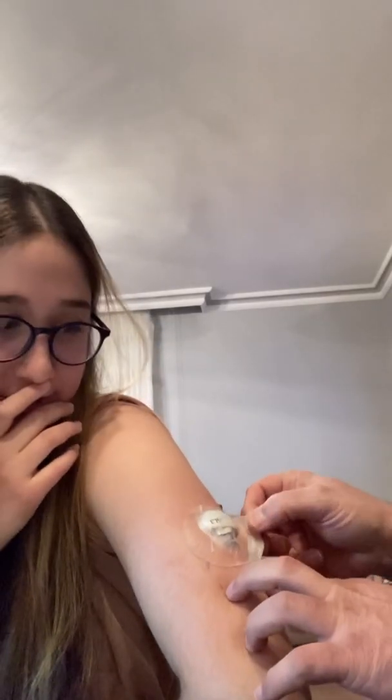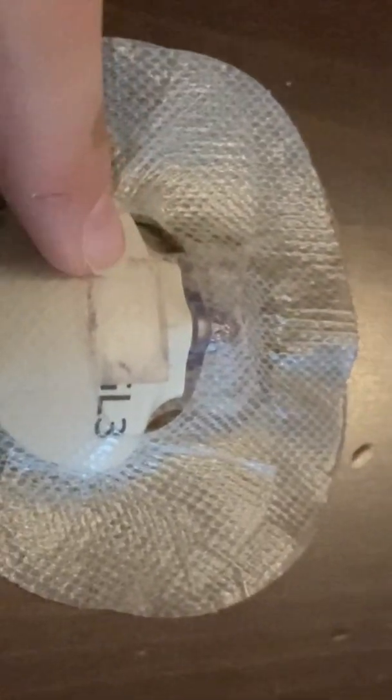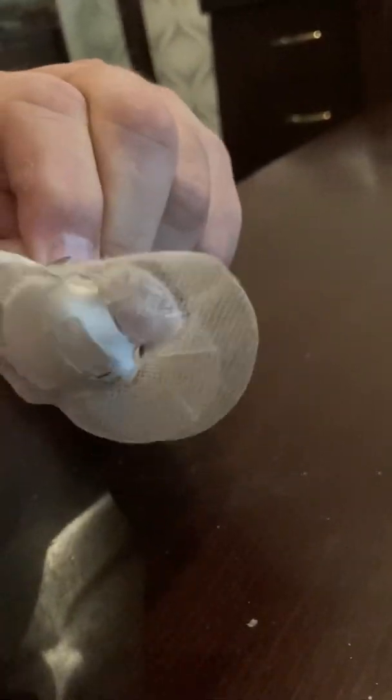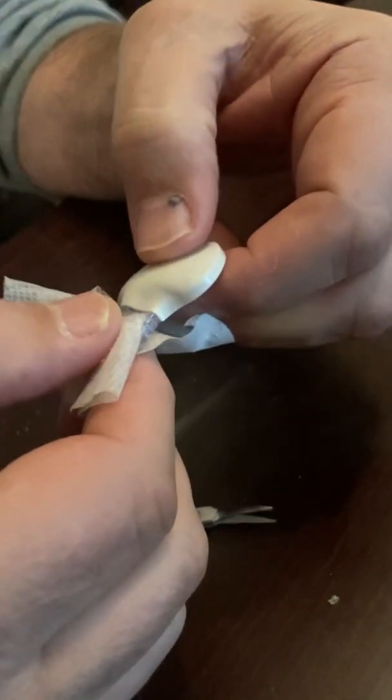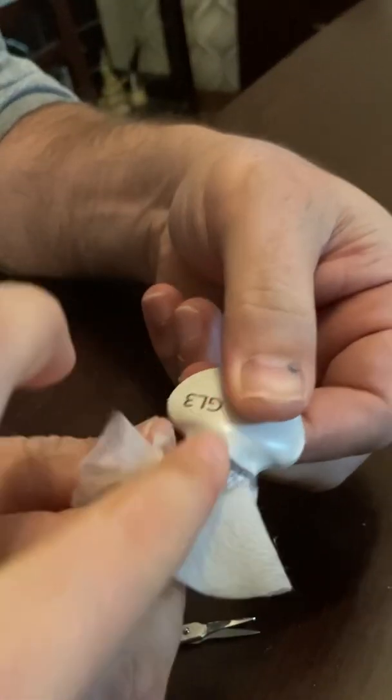Now we're going to take off the sensor. Here we have the sensor and the transmitter. First we remove it — it kind of hurts. So here we took off the sensor with the transmitter. We're going to clean the transmitter and charge it for about an hour. Now we're trying to remove the transmitter from the sensor.